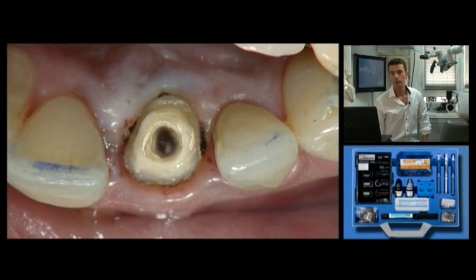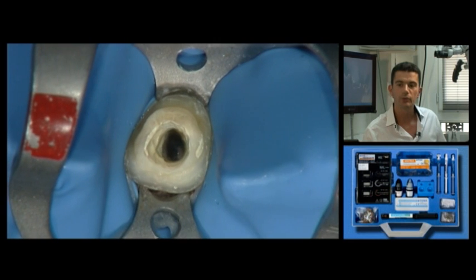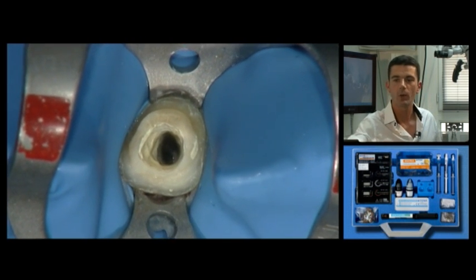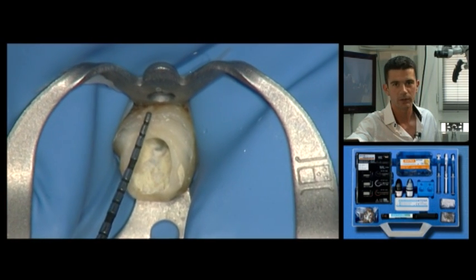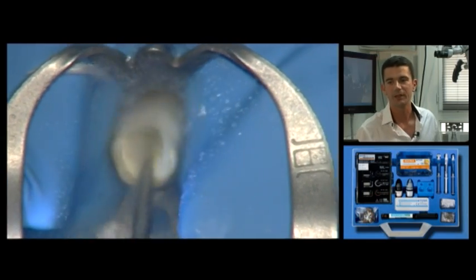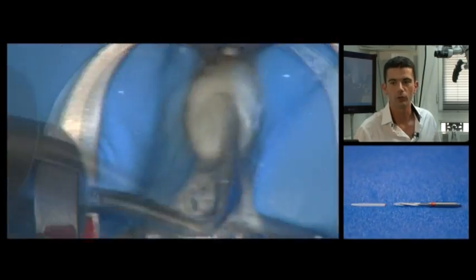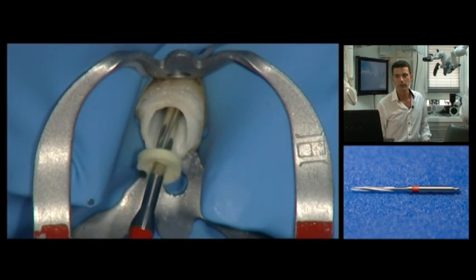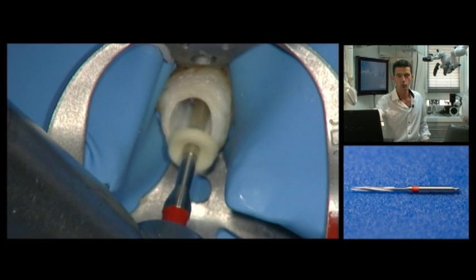This occlusal view already gives an opportunity for assessing the remaining walls. A rubber dam is set up. At this stage we analyse the remaining walls — we check for a minimum dentine height of 2mm and thickness of 1.5mm. Next comes mechanical cleaning, this time using ultrasound to further prepare the canal. The predetermined length will show on the drill, which must be checked and used to complete the canal preparation.